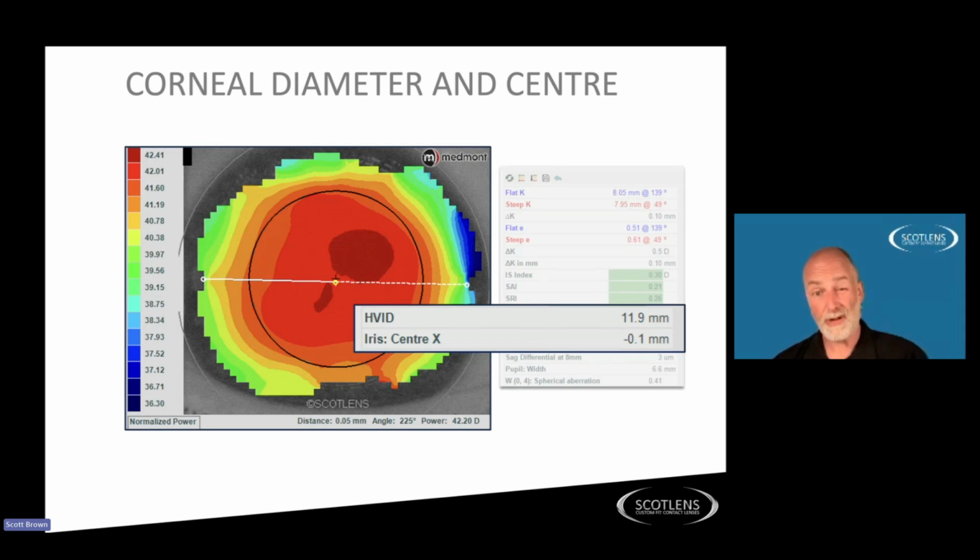So if you think about a multifocal soft contact lens, it tends to sit on the middle of the cornea. And if your patient has a large angle alpha, the visual axis will not be through the middle of the lens, so the multifocal optics get skewed, and that's why we quite often get poorer quality results with one patient, but we don't with another patient.